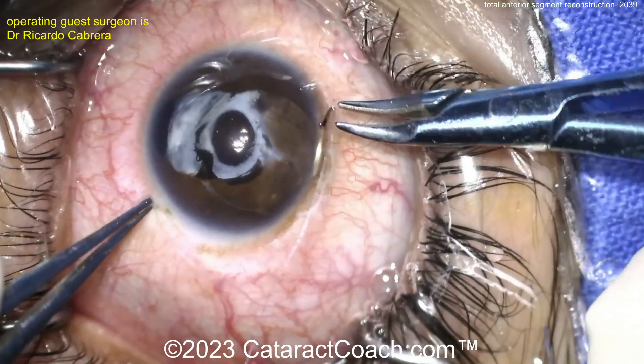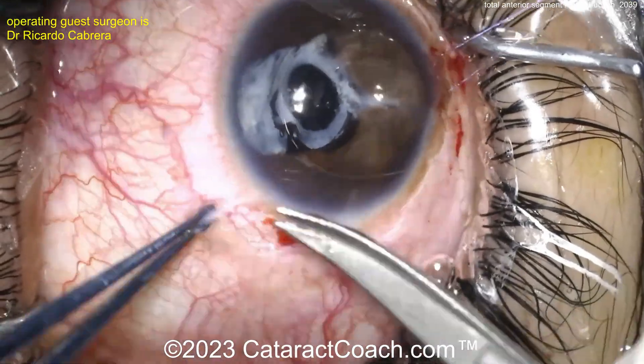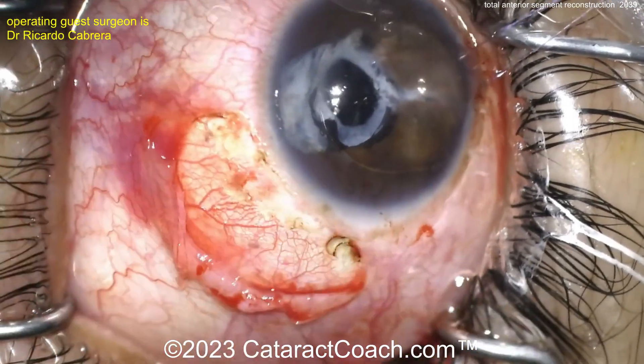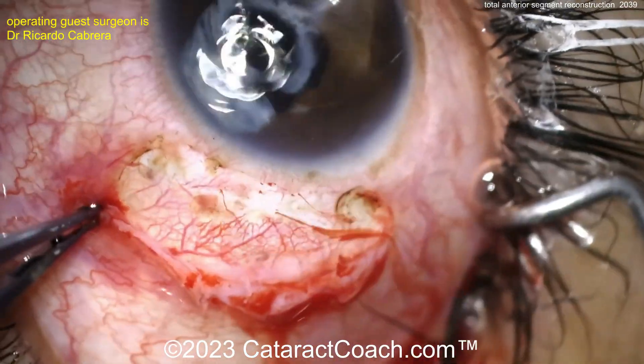This is a complicated case. Our guest surgeon here does an amazing job of a very tough case. Let's watch carefully. There's a little bit of a peritomy here.